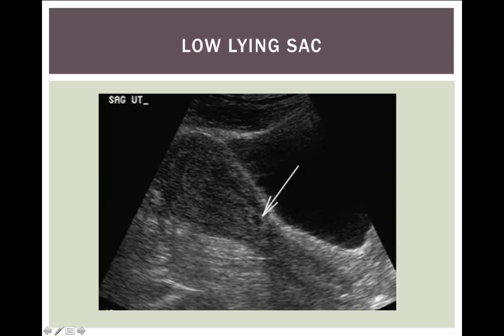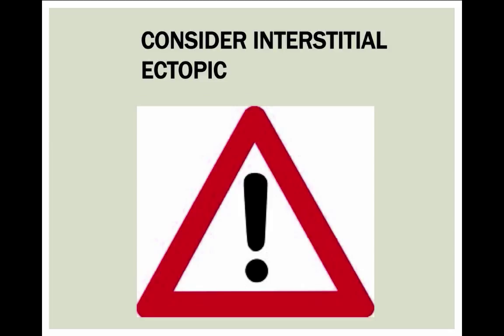This is an example of a low-lying sac. This is again high risk for miscarriage, but you've also got to think about the interstitial pregnancy. Interstitial ectopics are hard to diagnose, they have high risk for rupture, and usually patients tend to do worse because they bleed more and they're found later. That's why we talk about finding a properly placed intrauterine pregnancy - when you see a sac that maybe isn't quite in the right place or is low-lying, you need to think about an interstitial ectopic.